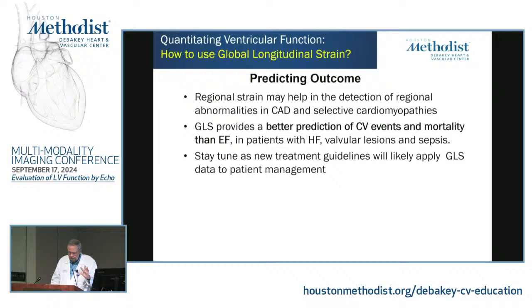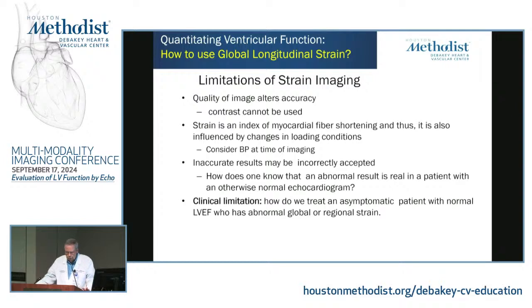The problem here is, as I said earlier, what do we do? So, limitations. First of all, you still need some decent quality, number one. Number two, it is an index of fiber shortening, and therefore it has been shown to have some dependence on loading conditions. For instance, it's always recommended to have your blood pressure reported at the time of the echo when you look at strain. It has been shown that over time, variations in BP can alter some of these numbers. So it is not 100% load insensitive. It has some loading sensitivity.